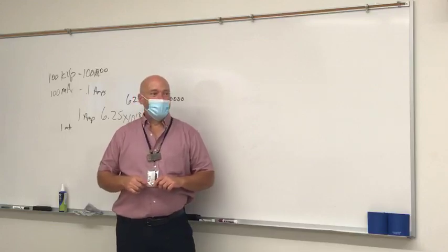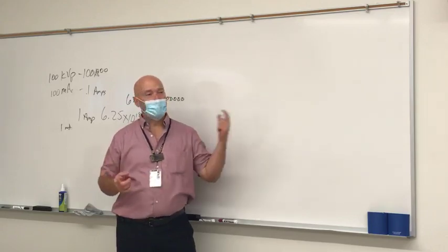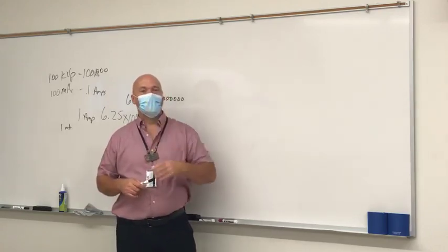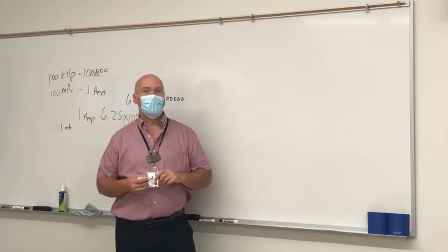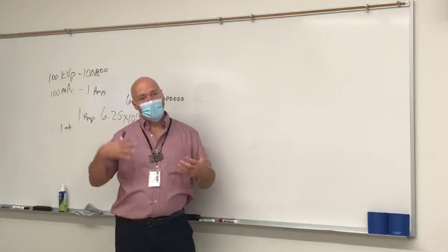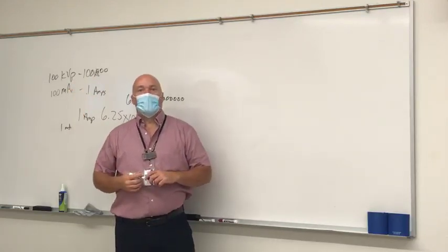So for different exposures, the amperage is gonna be different all the time? Amperage is going to be different. kVp is going to be different. For example, kVp controls the penetration of the X-ray beam, so we want high kVp to penetrate.